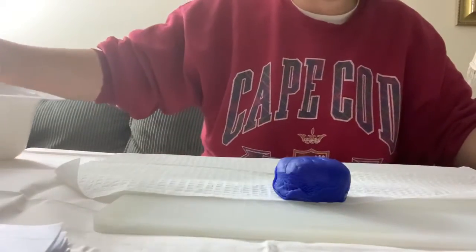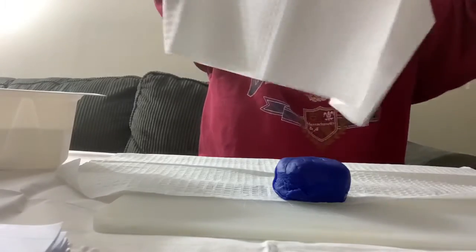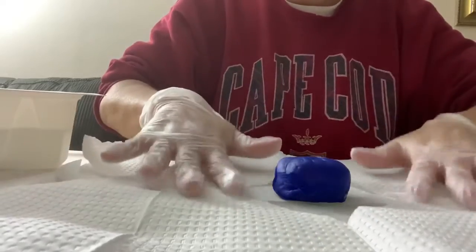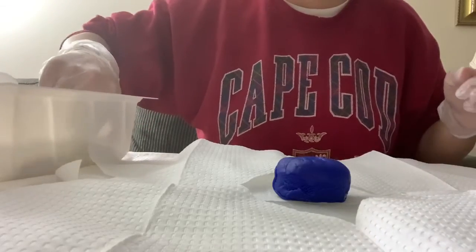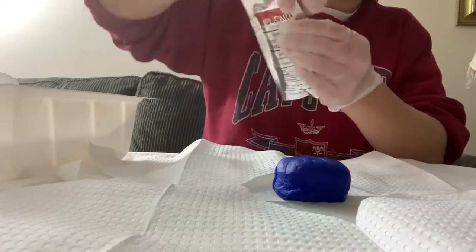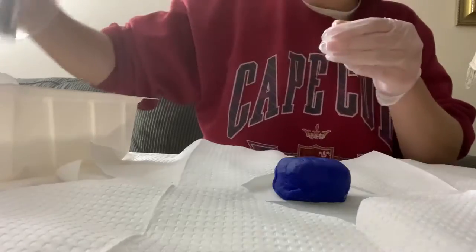Then the next item in my kit here is the fenestrated drape. And again, I'm just going to pick it up by the corner and place it shiny side down. And this kit has a specimen cup, which I'm just going to set aside because we don't need that. It has my iodine swabs. So I am just going to open these up carefully. Put those in my kit.